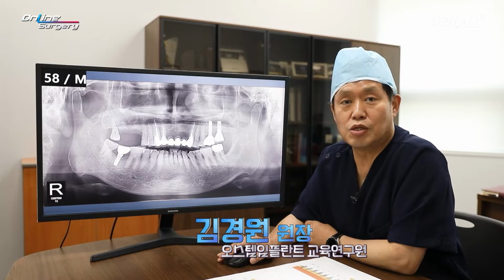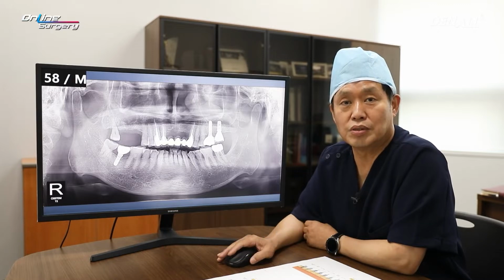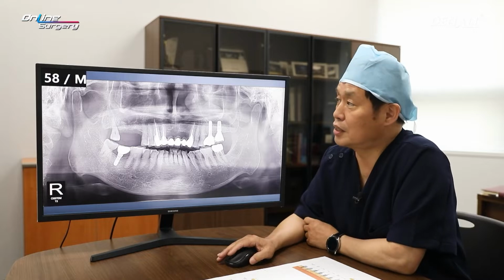Today, let's look at a surgery using OneCAS. First, let's take a look at the patient.